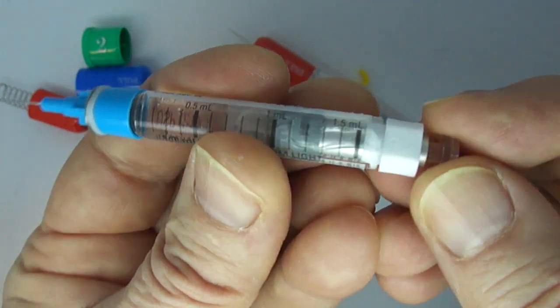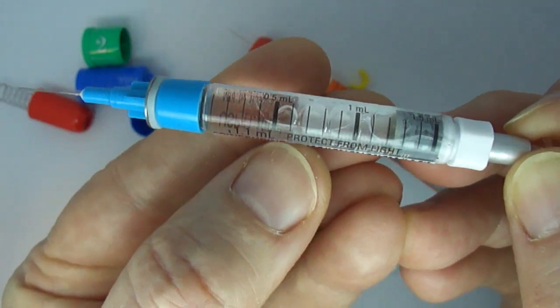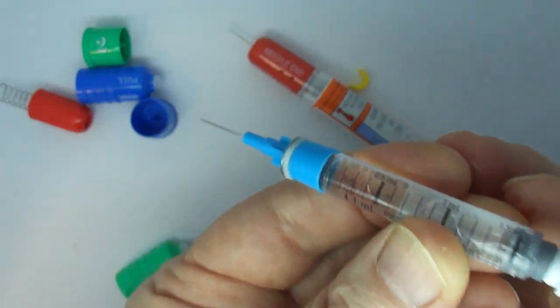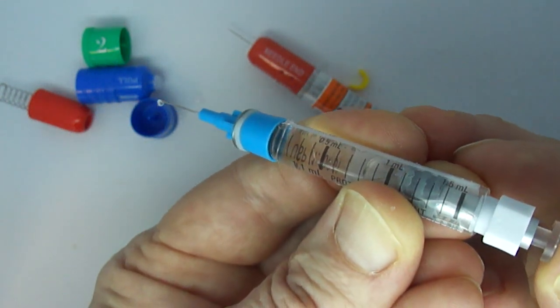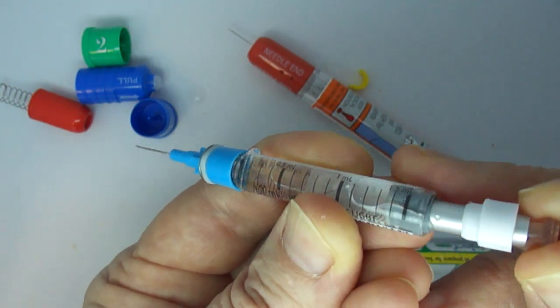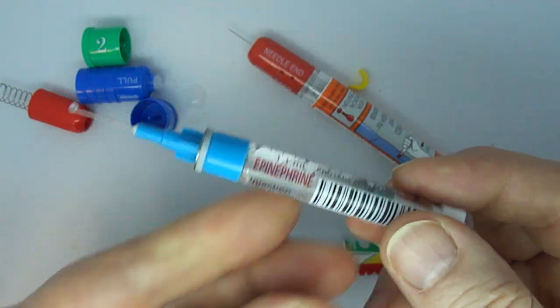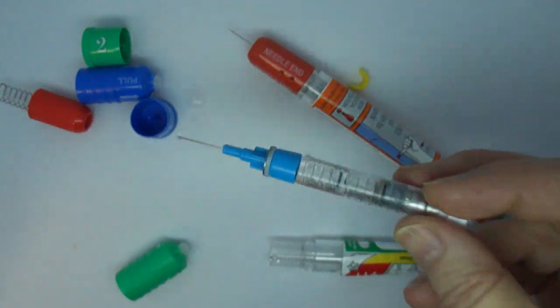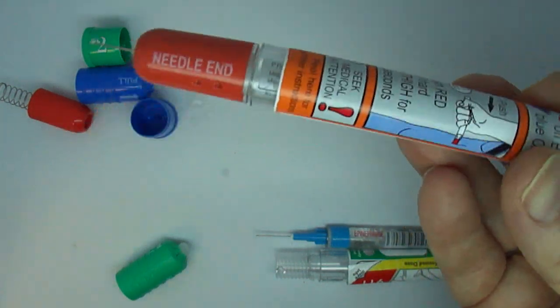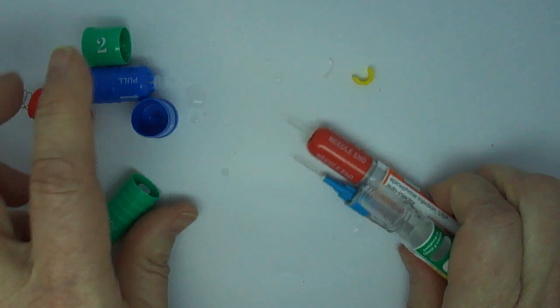And what you do is you pull back the plunger to the settings. It marks the little distance there, and then you can administer an additional dose. And again, pull back the plunger and administer an additional dose. So that's a pretty nice feature of that device, no longer available. Turns out this device is identical in every way except for allowing you to pull off that cap.